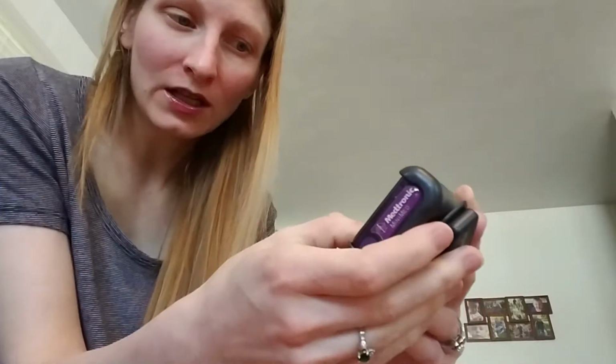And then it wants to know if it can fill the cannula. If I had just changed my infusion site, so this was brand new in my skin, I would actually need to prime or fill the cannula too, because that's approximately 0.7 units of insulin that it takes to go through that little tubing. So if I didn't have that and I start giving insulin, again, a missed dosage, it wouldn't be accurate. And then I would go high because I have air in it and I'm not getting the insulin, I'm getting the air instead. So those kind of details.